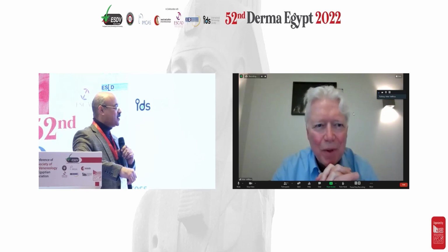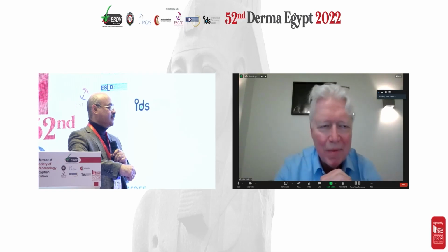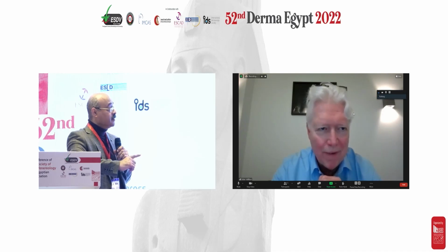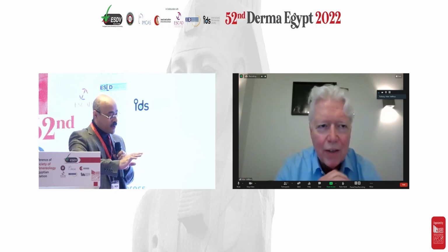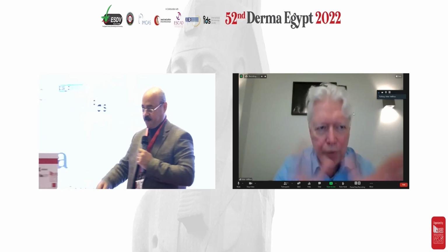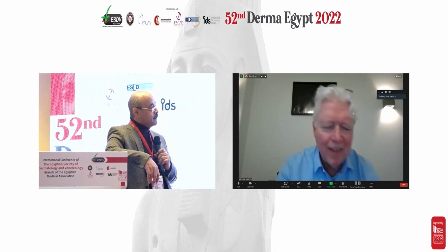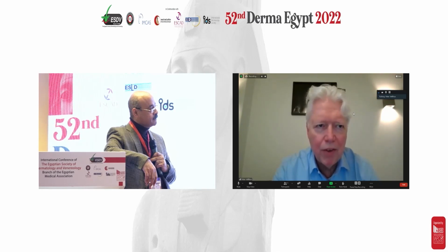Good. Stretch marks, they really work. They become smaller, and I use the fractional CO2 laser for that. In dark skin? Yes, also in dark skin. What about PIH, post-inflammatory hyperpigmentation? Not so much. You see that, but of course we decrease the fluence, and also we put the points more apart from each other, and it really works. But people are not so happy with it because the end effect after several treatments is not so very good.